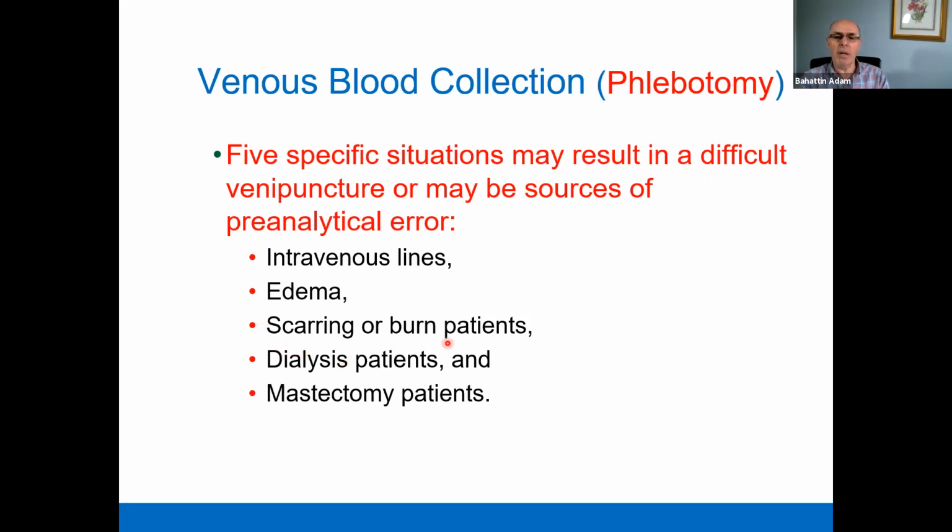Scarring or burn patients may be another difficulty, because you won't be able to see the vessels, the veins, due to the scarring or burns.